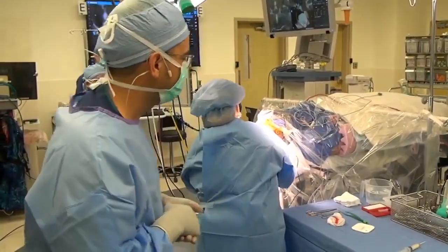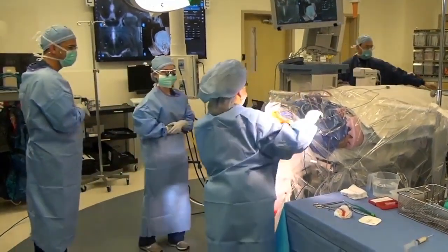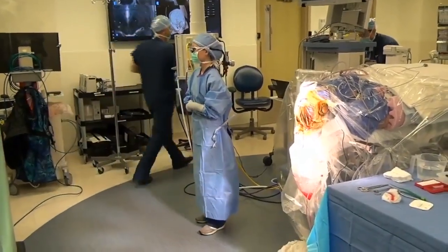Yep. Sure. Here, let me take a look at the stealth again.